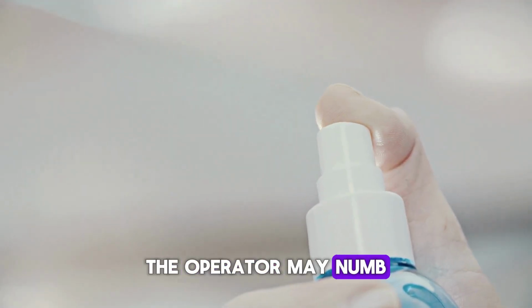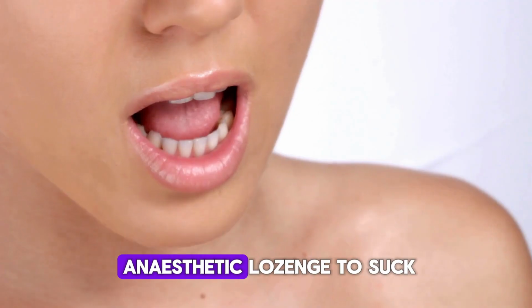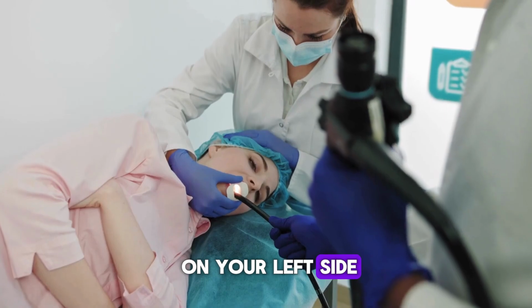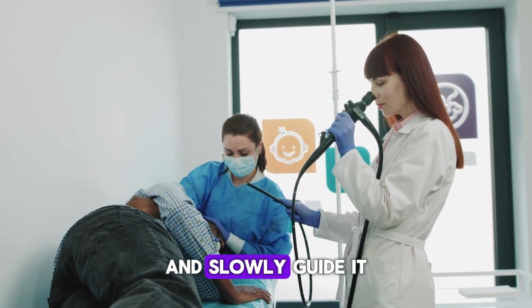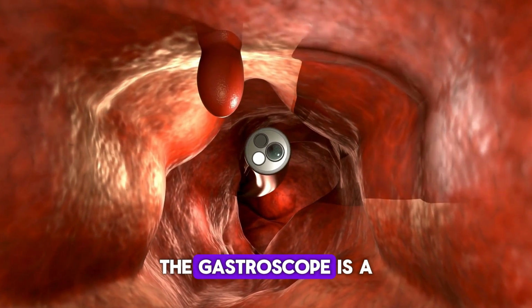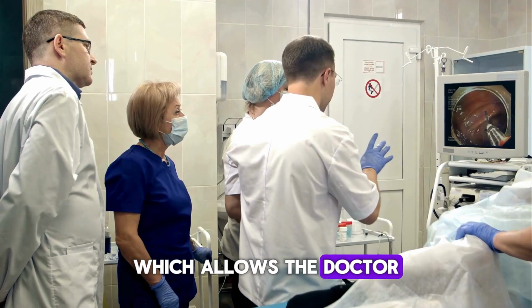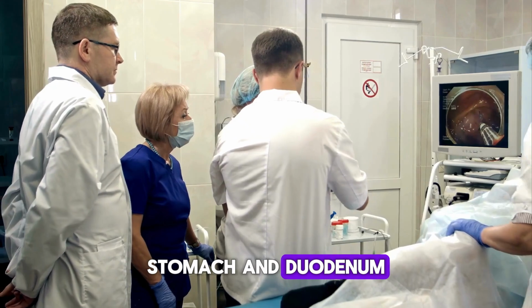The operator may numb the back of your throat by spraying on some local anesthetic or give you an anesthetic lozenge to suck. You will be positioned on your left side. The doctor will then insert the gastroscope into your mouth and slowly guide it down the esophagus and into the stomach. The gastroscope is a flexible tube with a light and camera at the end, which allows the doctor to visually evaluate the lining of the esophagus, stomach, and duodenum.